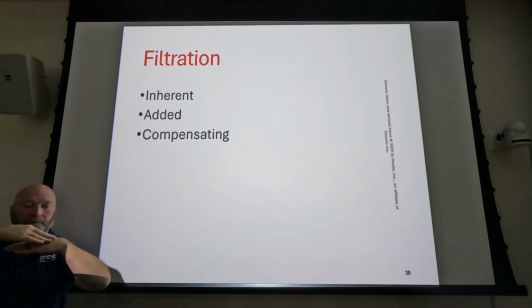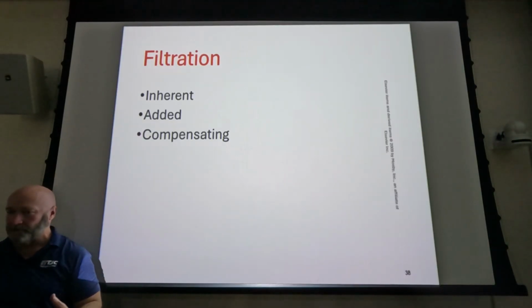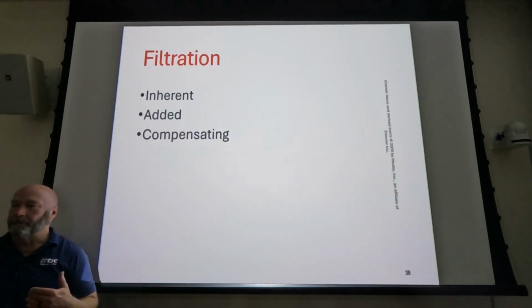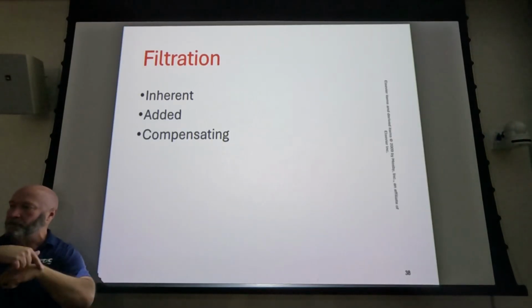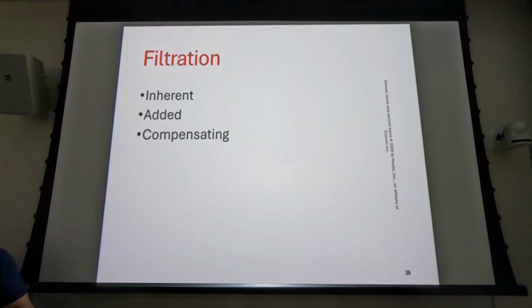So if the patient complained of pain in the toes, on the toe end, then you would shoot with a totally different technique than if the patient said I dropped something across my forefoot, the proximal portion of the foot. You'd use a different technique for that. The problem is if you shot for the toe, your film was too light for the forefoot, and if you shot for the forefoot, it'd be too dark for the toes. Your computer really kind of takes care of all that. You don't burn out the toes if you shoot with a foot technique anymore.